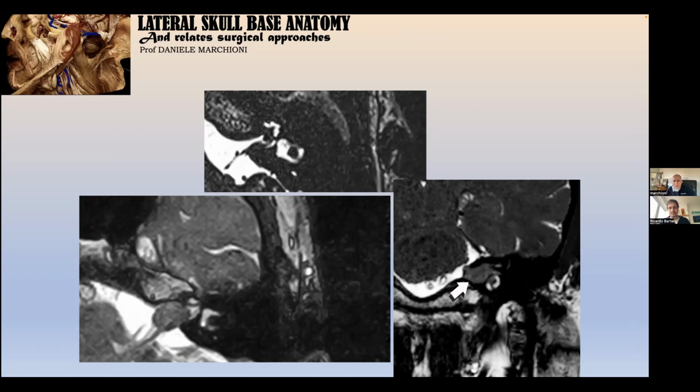And so one of the targets in this case is just the fundus of the internal auditory canal. And you can see the external auditory canal is here, and the cochlea is here, and this is the fundus. And this way is our target, working in this area.